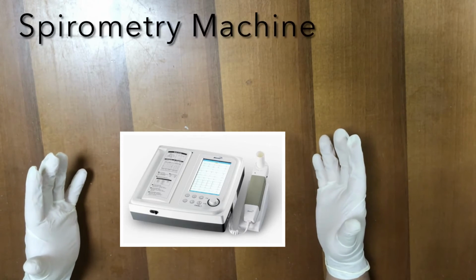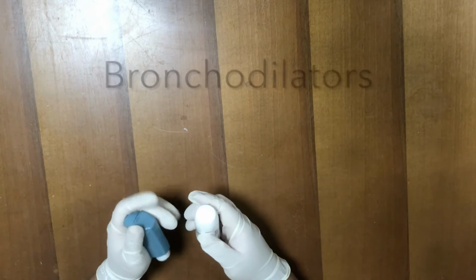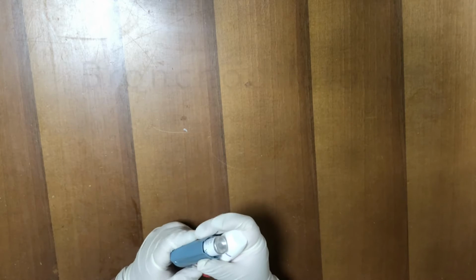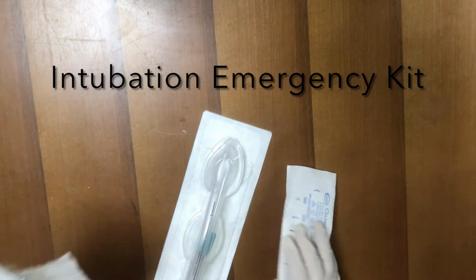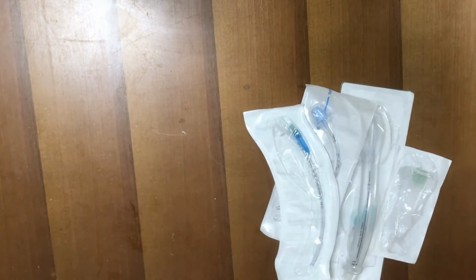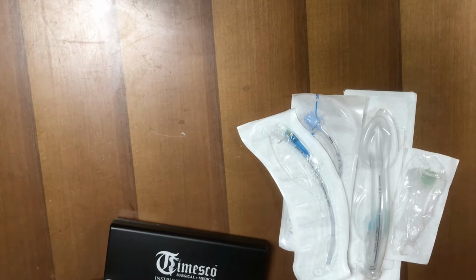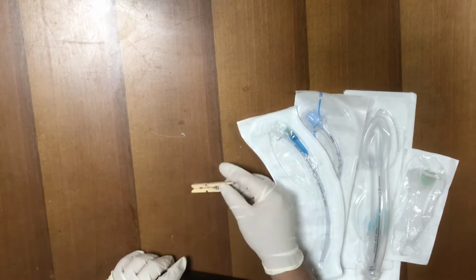So before starting our return demonstration of the PFT through the spirometer machine, of course, we need the spirometry machine. And then after that, we need the mouthpiece. And then, of course, we shouldn't forget our bronchodilators, just in case any emergency occurs where a patient has an asthma attack. And then, after that, our intubation emergency kit: endotracheal tube, laryngeal mask airway, and your oropharyngeal airway, and also, of course, your laryngoscope with all the different sizes. And then lastly, our patient's nose clip.